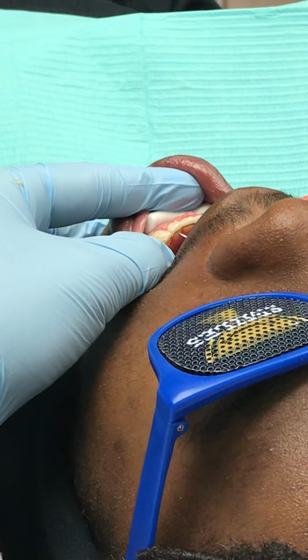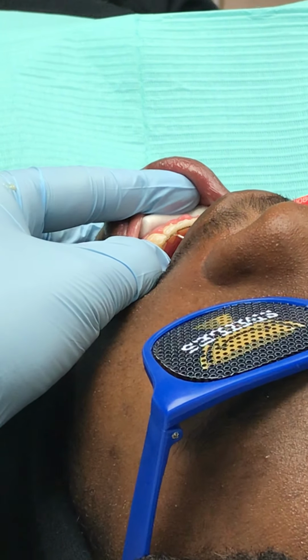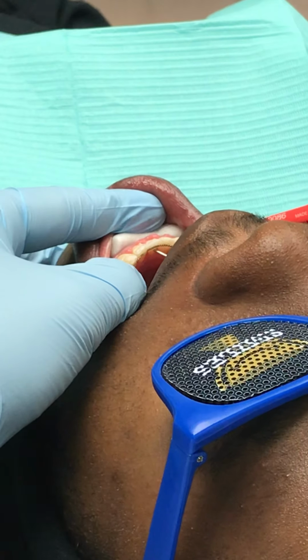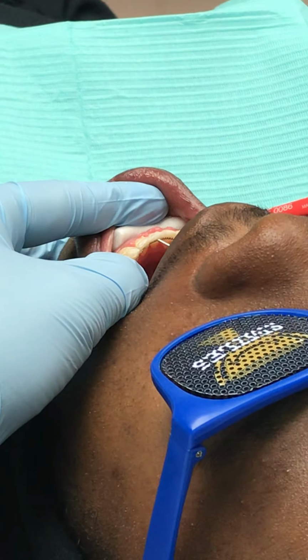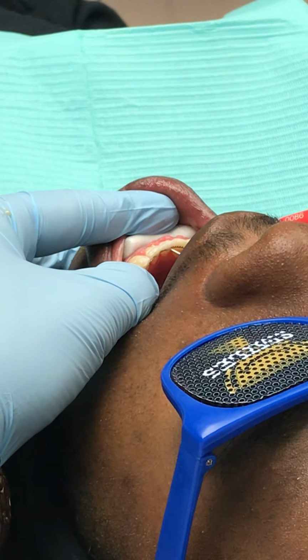So again, I started on the gingival aspect, then I went up to the incisal aspect, and then I went over the wire. I did that twice just to make sure that I had enough thickness of the material. Okay, again, gingival, incisal, right over the wire.